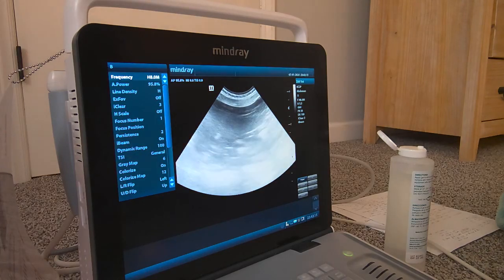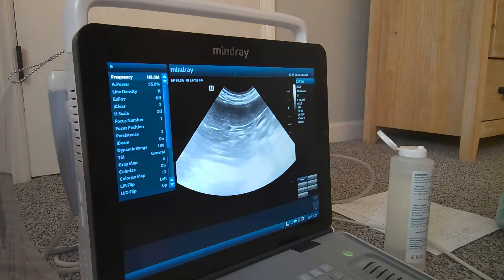There are no published normal sizes for the width and diameter of the spleen. But if you're looking to compare from one scan to the next, a lot of times I'll measure the width at the area of the hilus, just to keep a common area that I'm measuring.